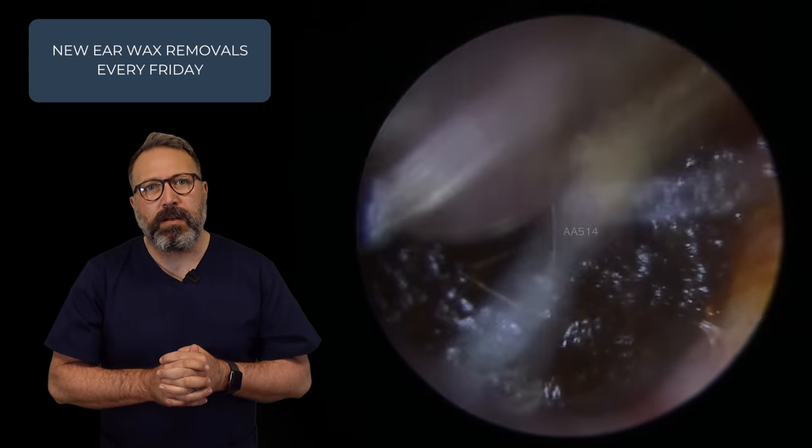Oh my goodness, we had to fight for that one. There's still more in there — so we'll go behind this next section now, draw this forward. Oh my goodness, this wax was going in such a long way. Let's start scooping this forwards. Out that comes — that's a big chunky bit of wax, that one. But look at that behind it, looking really, really good. Six centimeters, two and a half inches. I told you I'd forgotten I'd done some of these this week — oh my goodness, that is a lot of debris. You can imagine how pleased that particular patient was to get that out of their ear canals. That was a heck of a lot in there.